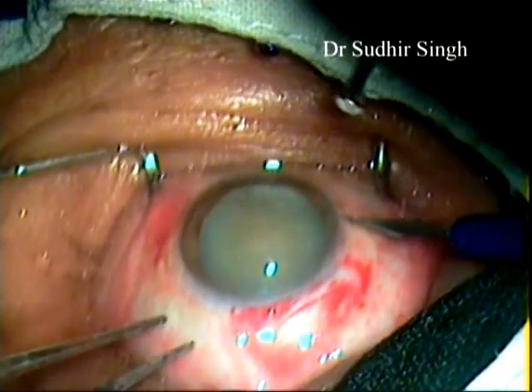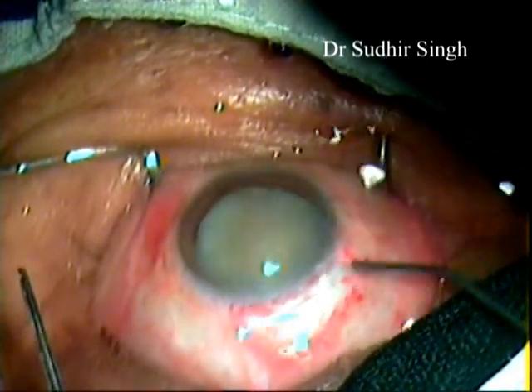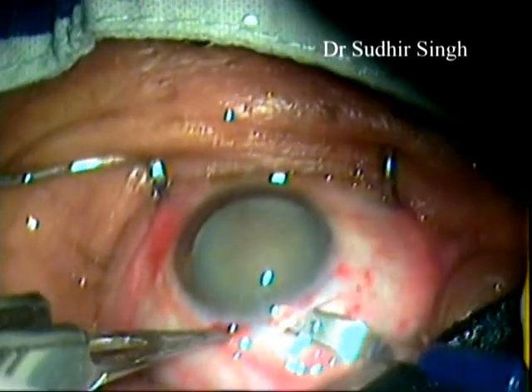A paracentesis incision is made and BSS is injected into the anterior chamber to make the eye tight. A sclerocorneal tunnel is made with a crescent knife.